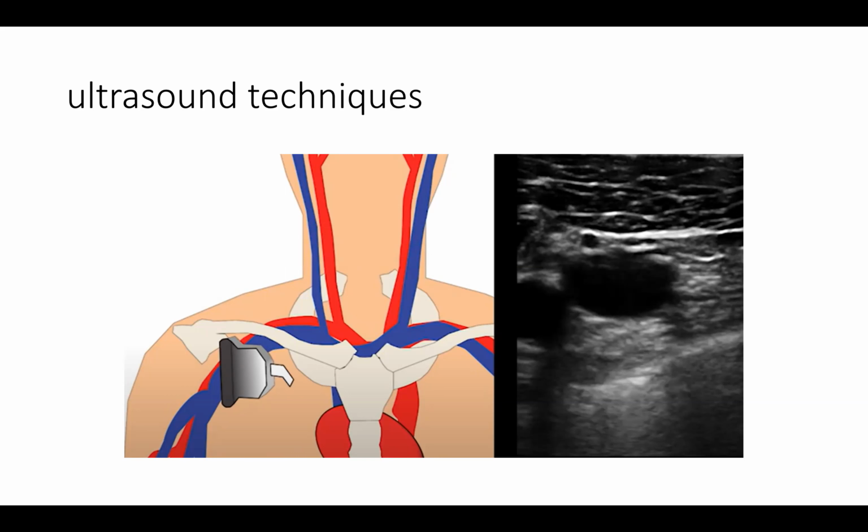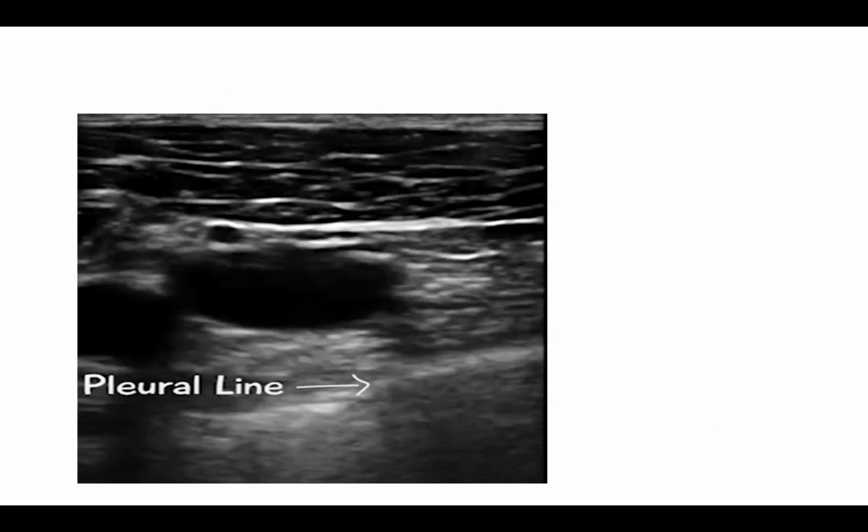And when that is done, you now take your puncture needle and direct it. But the key thing about this is that when your needle is going through the tissue down, the tip of that needle should be captured by the ultrasound. If the tip of that needle is not captured, you just withdraw it back and take a direction where you'll be able to see it being captured.